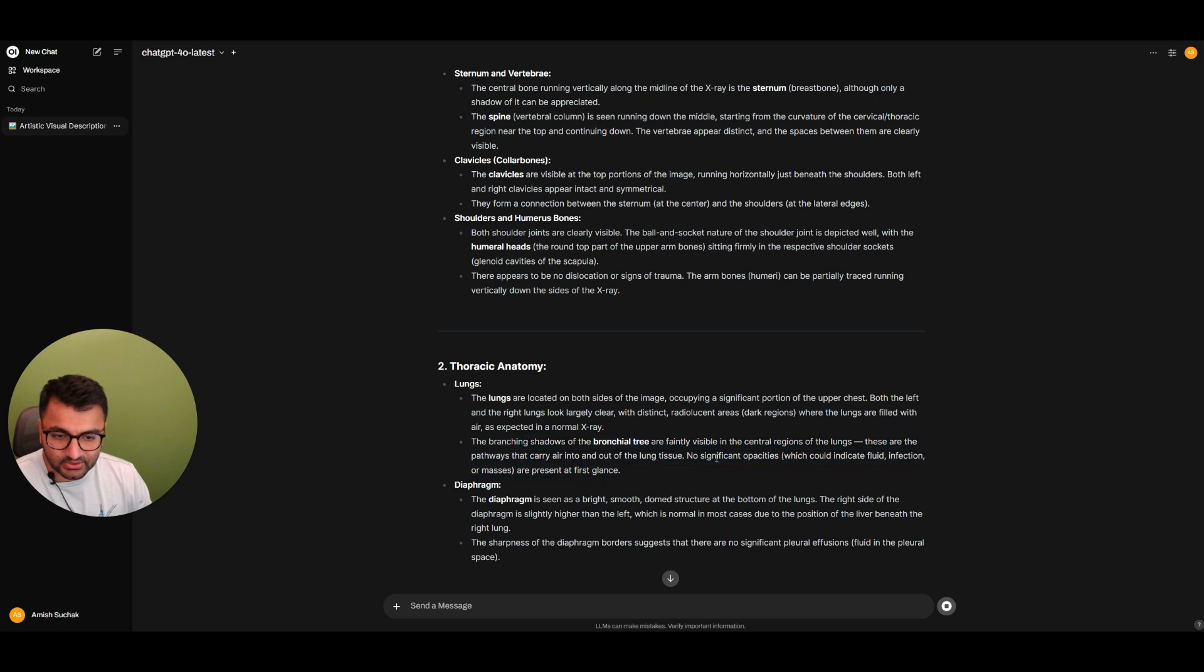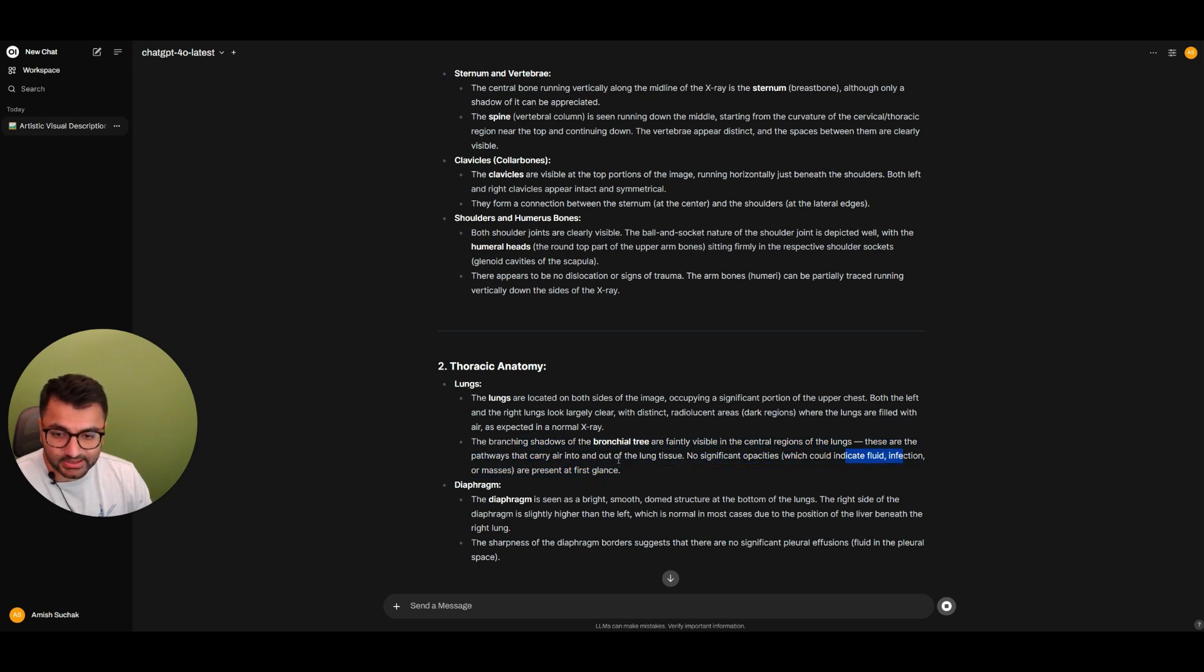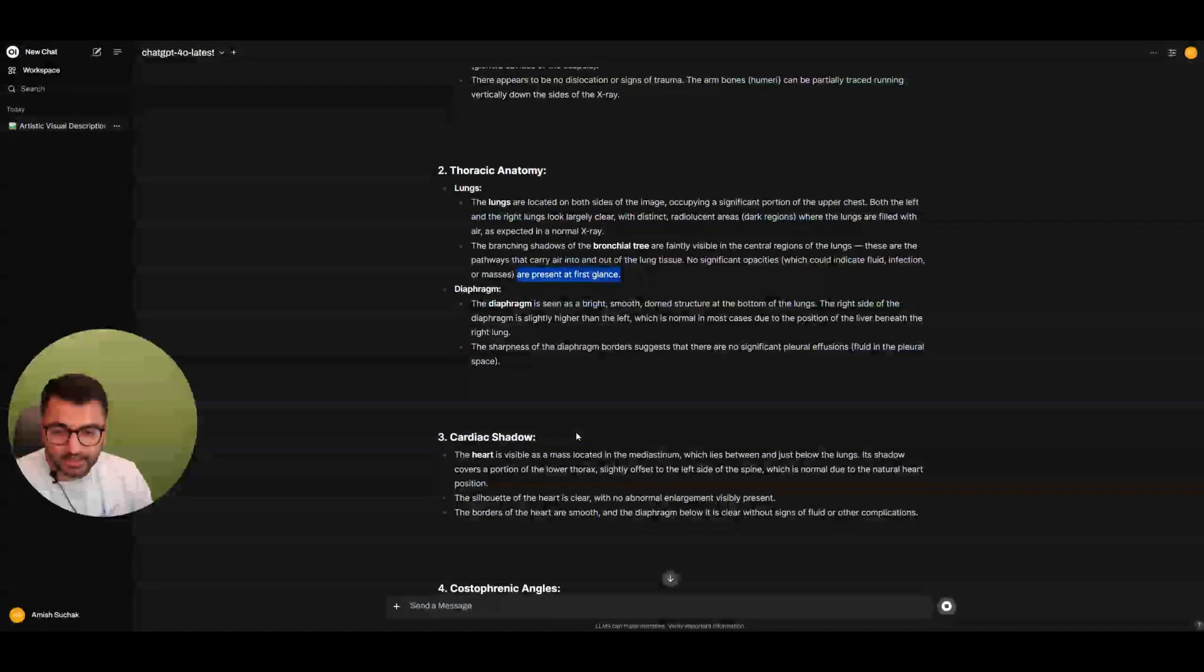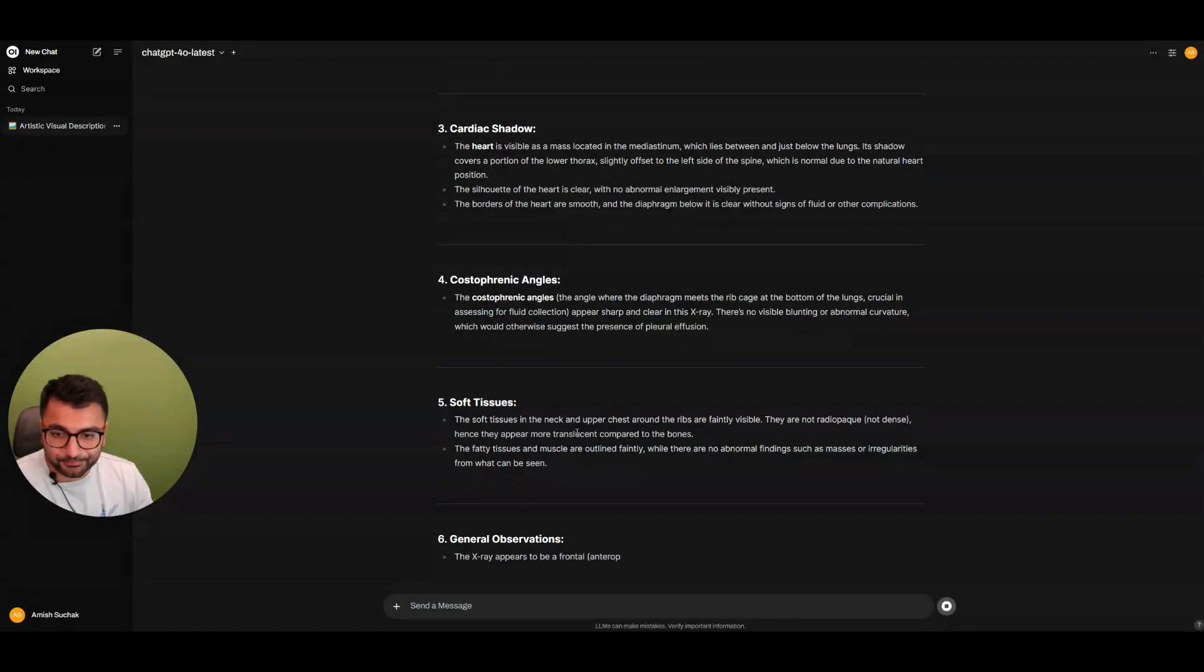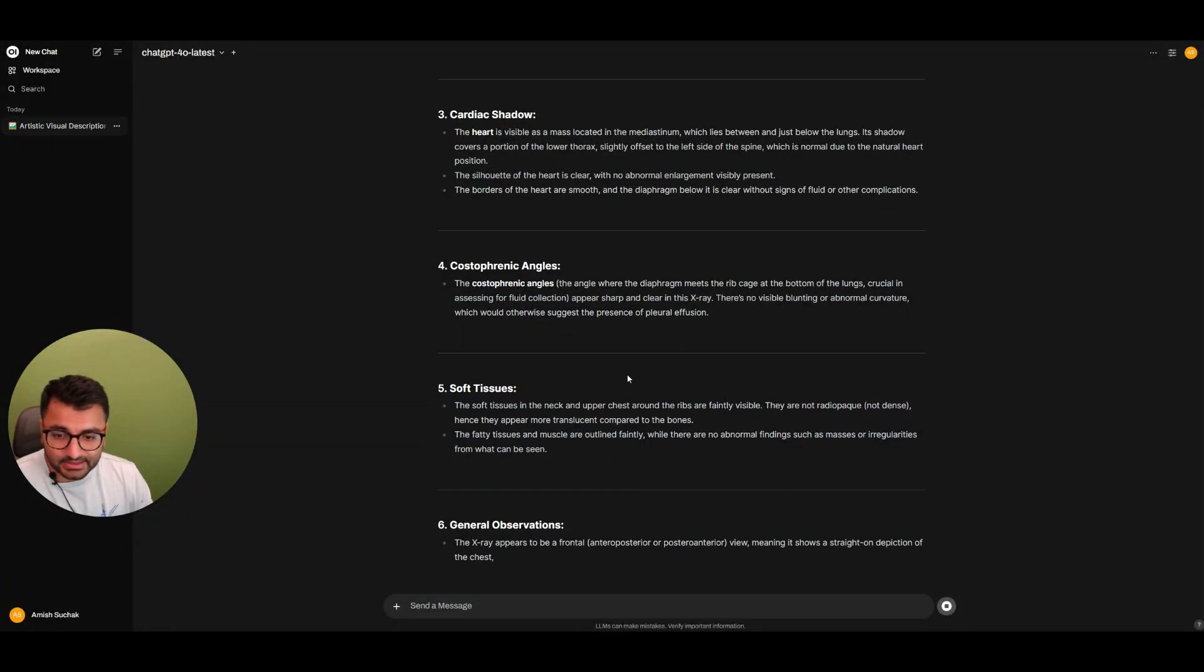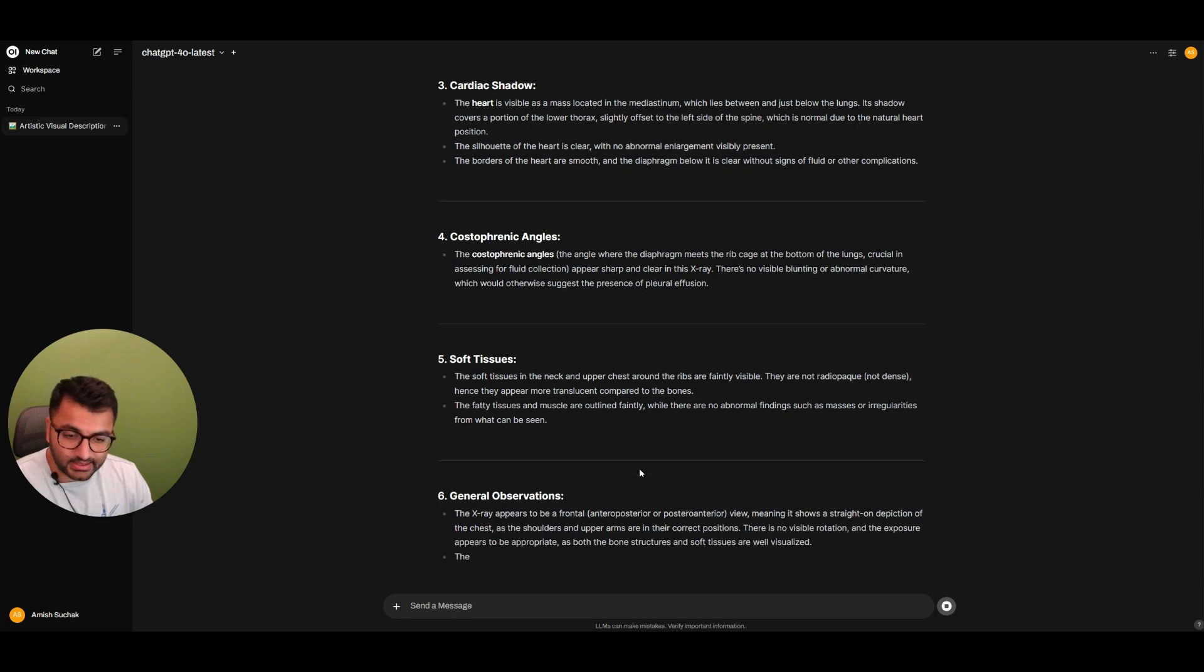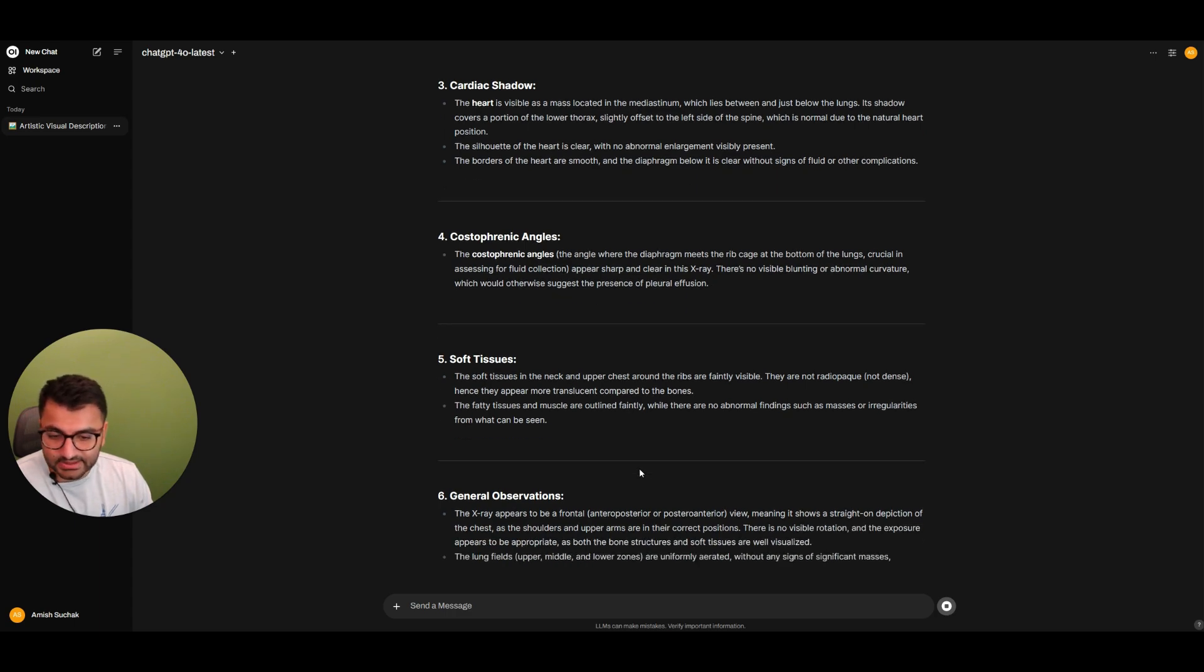No significant opacities which could indicate fluid infection or masses are present at first glance. And see, it does give a very detailed and thorough description.